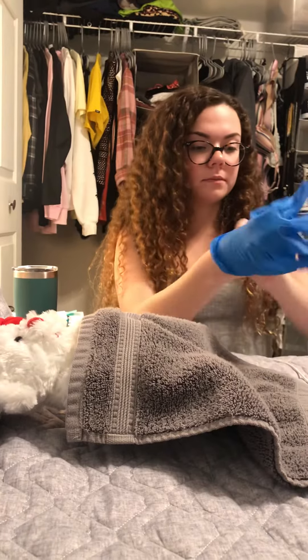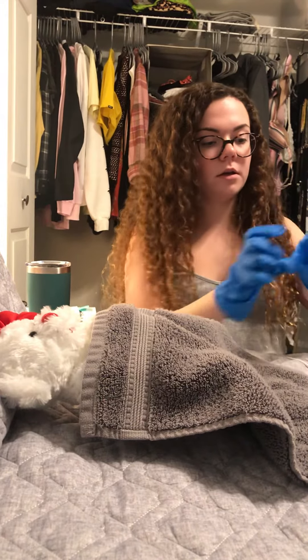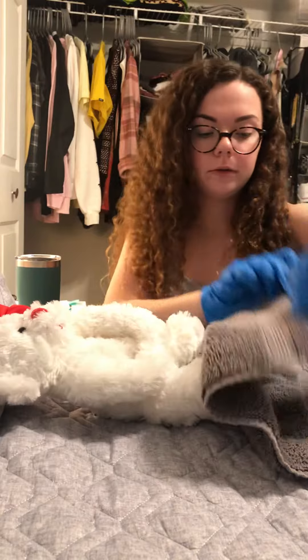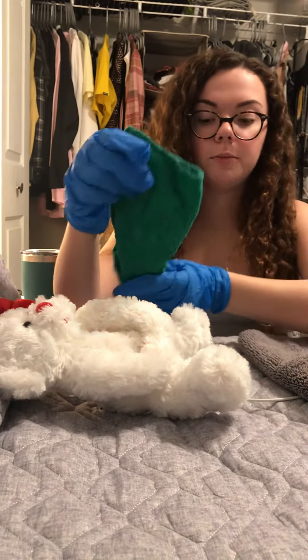Then I would perform hand hygiene and put on my gloves. I would remove their blanket, pull it down. Mr. Bear, I'm just going to pull your blanket down. And then I would give them a bath blanket to provide privacy.